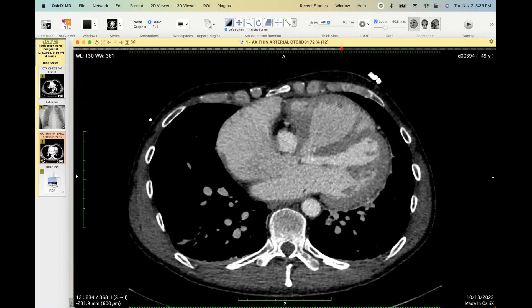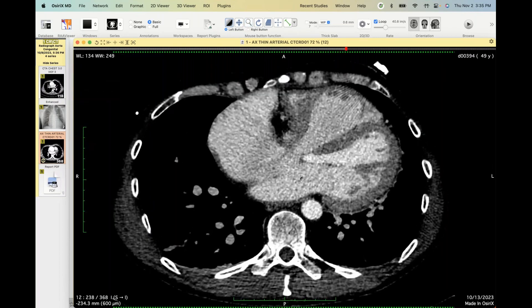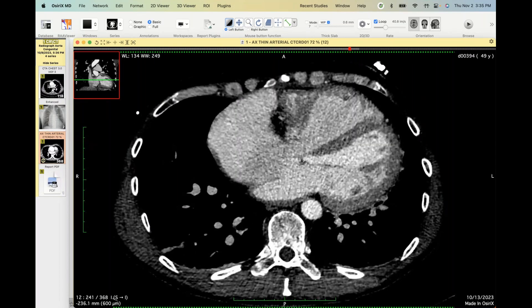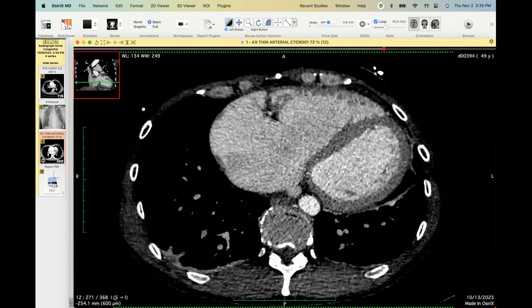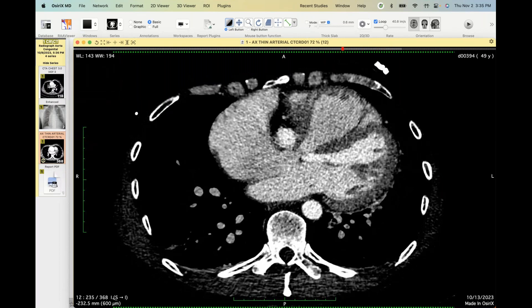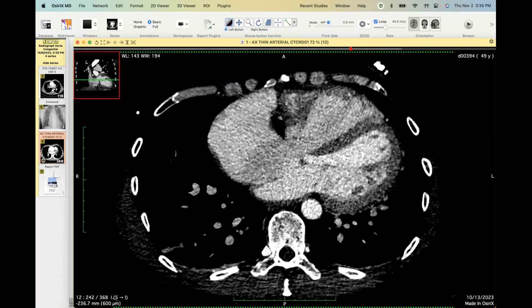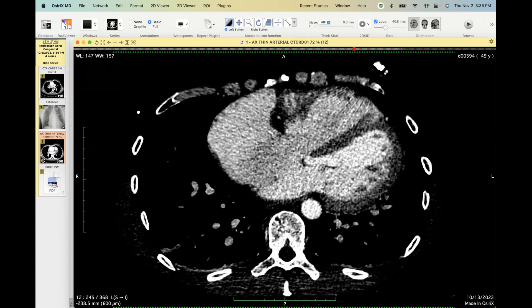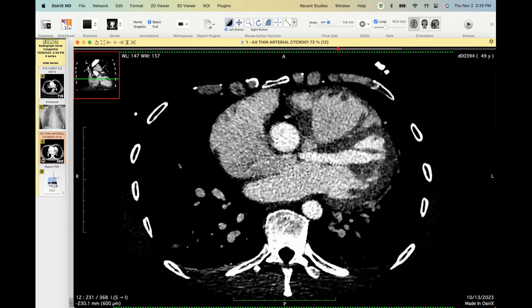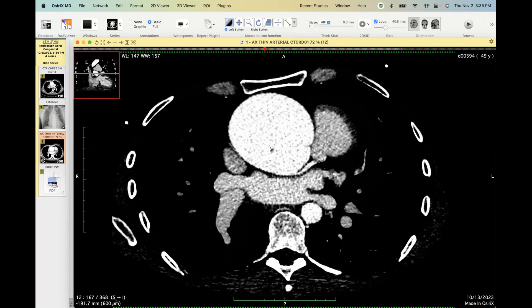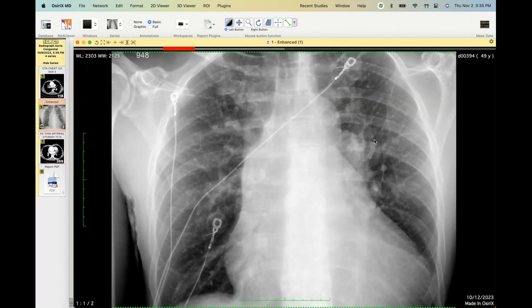This 49-year-old with only a history of systemic hypertension presented to an outside hospital with dyspnea. He was transferred to us when they found his aorta was eight centimeters plus, and echo showed a shunt. At surgery, this was called a primum-like ASD — no complete cushion defect, the tricuspid valve was mildly less apically displaced than typical, and no VSD. They patched the ASD and did an ascending aortic replacement. The enlarged vessels jumped out first; the aorta snuck up on me — impressive how large an aorta you can hide on a radiograph.